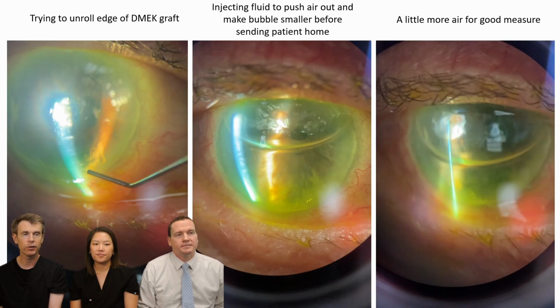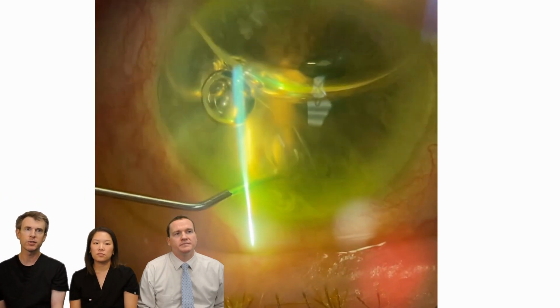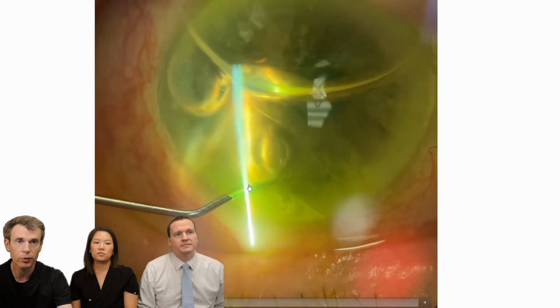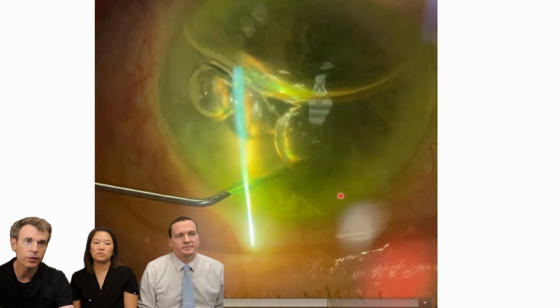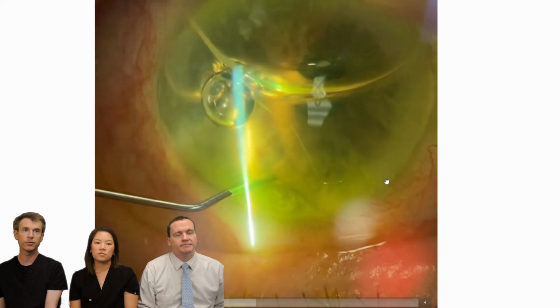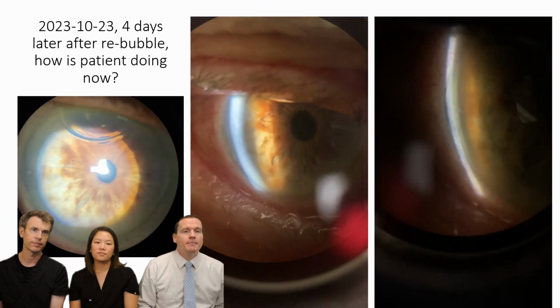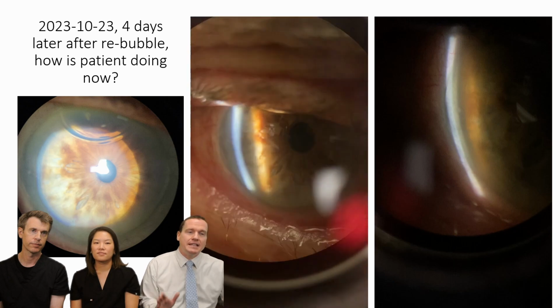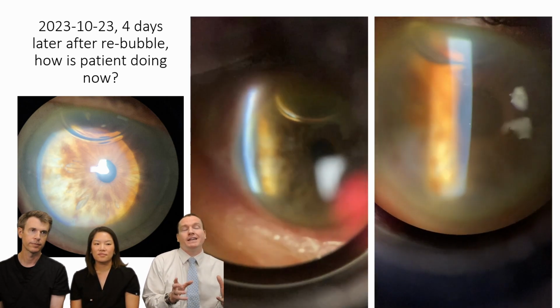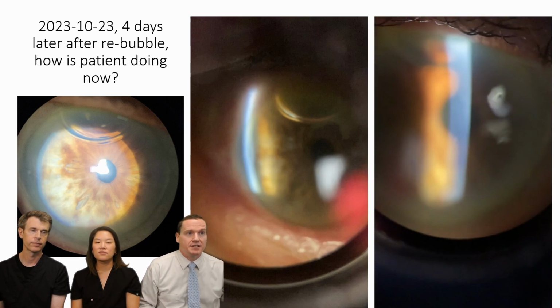So DMEK and DSEK, the other big difference, and also sometimes helpful in choosing patients, is the patients need to be looking up for quite some time, and that can be stressful for, let's say, an elderly patient, or if they have some neck problems. And here you see that movement of that DMEK tissue, see how fine that is now in response to just an air bubble. So was it all worth the trouble? 4 days later, they came back, and absolutely, that cornea, the DMEK is now reattached. They did very, very well, and you can see how clear that cornea is, with a little air still left in the anterior chamber, but yes, it was worth that trouble for the patient, for sure.